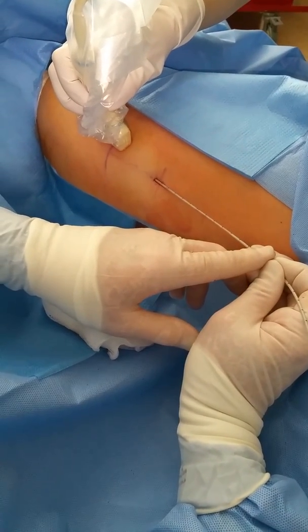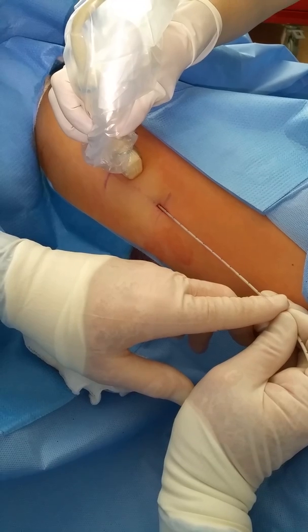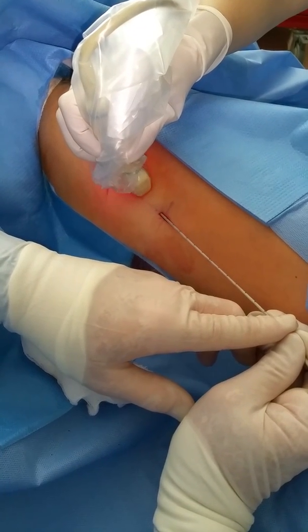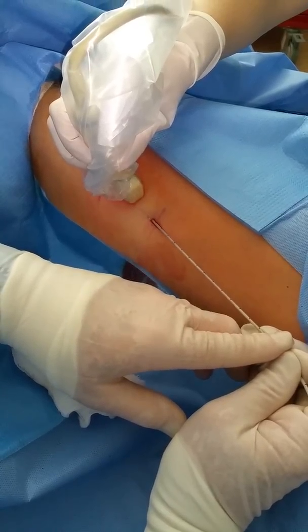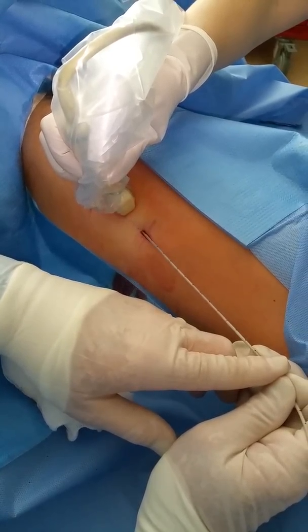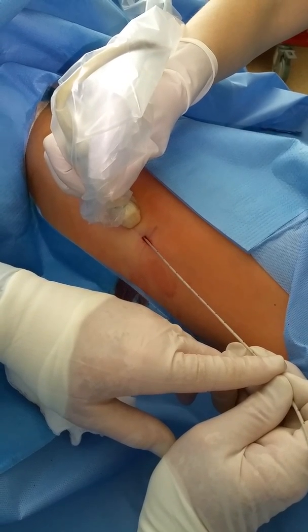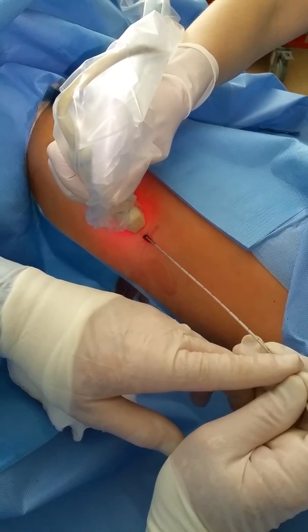We're getting close to the end. As we get close to the end, I'm going to tap the laser three times so we get good coagulation, which minimizes the bruising. This is looking real good.